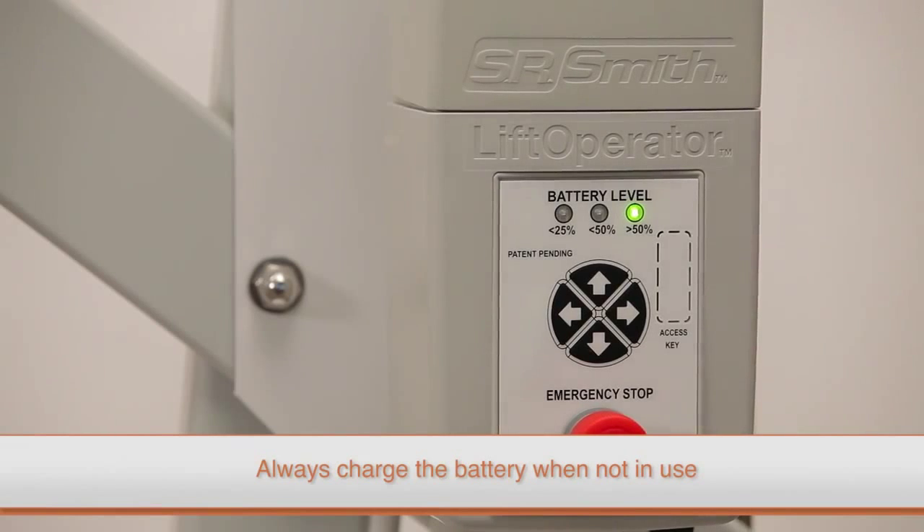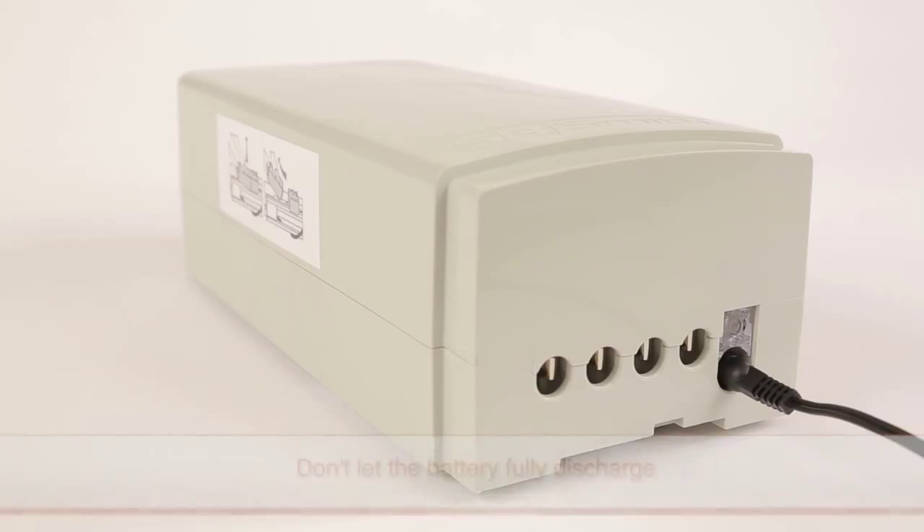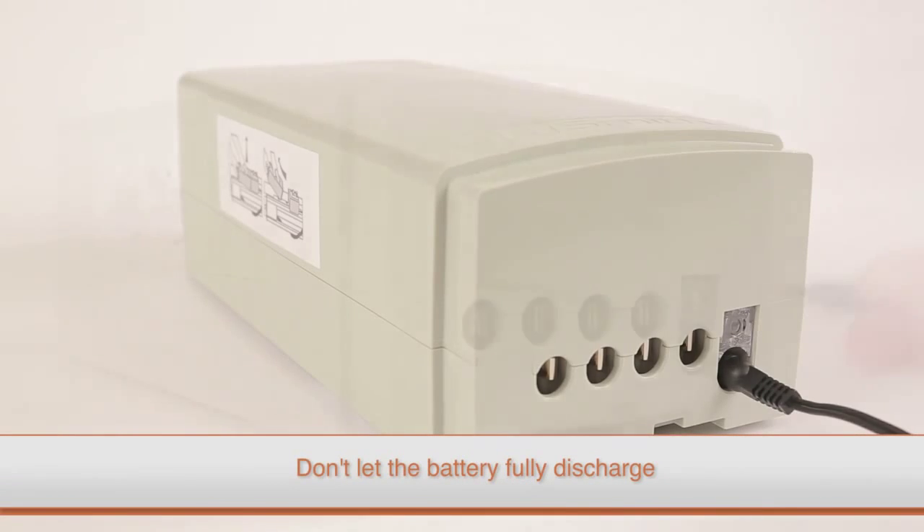It is important to remember to charge the battery when the lift is not in service. It's critical to not let the battery fully discharge, as this can affect battery life and performance.